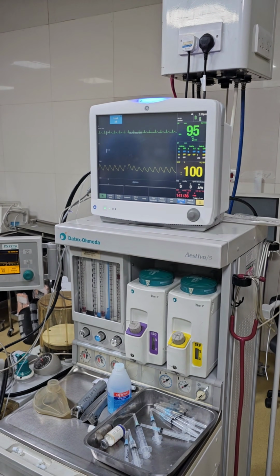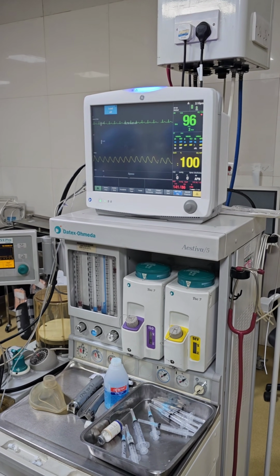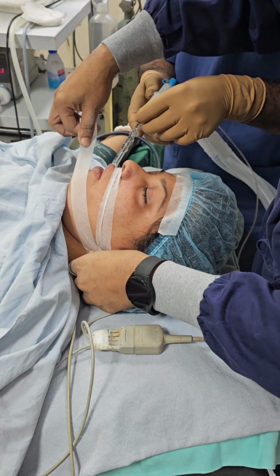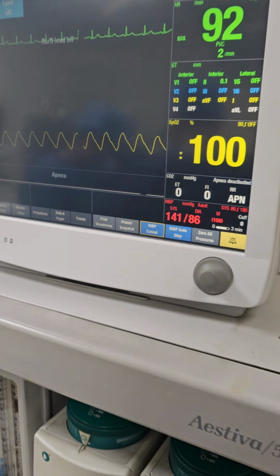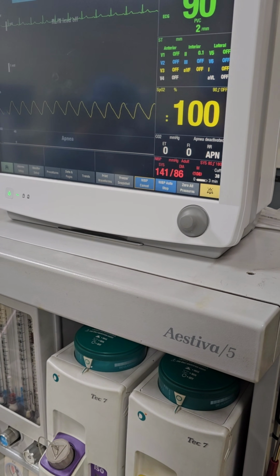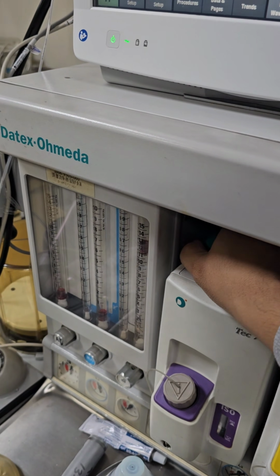And we are seeing the monitor, which gives the data after induction and intubation. There is no high increase of blood pressure or heart rate, and now we are seeing some rise of blood pressure and heart rate after the intubation reflex, but it has been almost perfectly controlled.